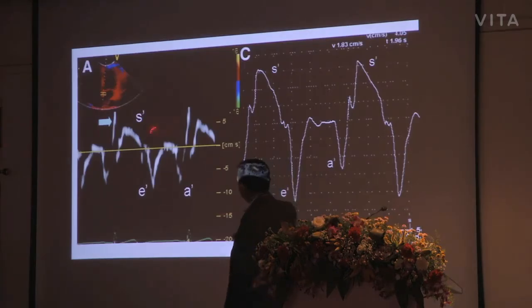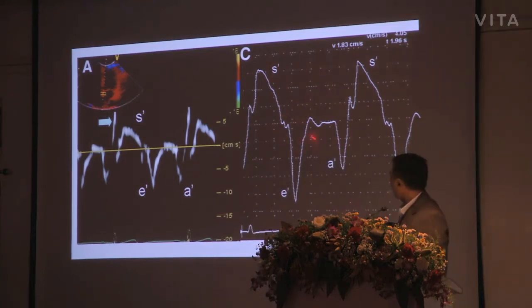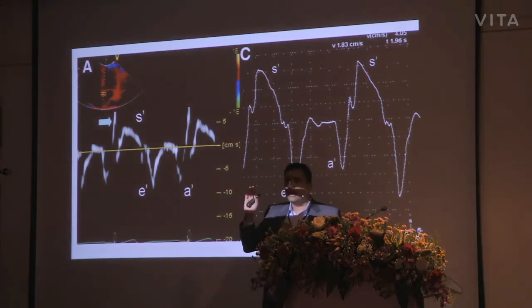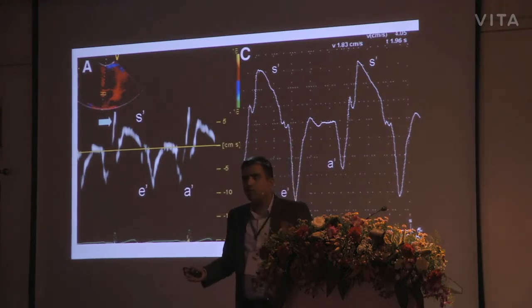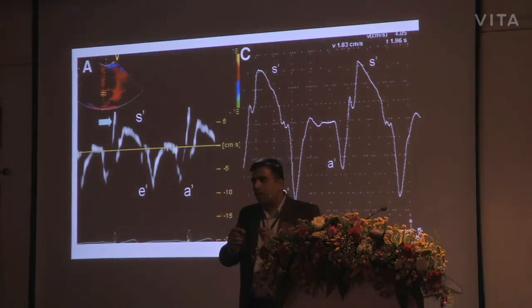Now, this is what we are used to. And this is what I want you to get used to now. This is the output we get from parametric imaging. It is our job to be able to decipher all these different curves over here and make sense of them. You may not need to use these in the future at all, because things are becoming more automated, but it is important to know. And knowing what you are seeing and knowing what you're doing is, as Baba said, one of the most important things to do. Not doing things without knowing is the most dangerous.